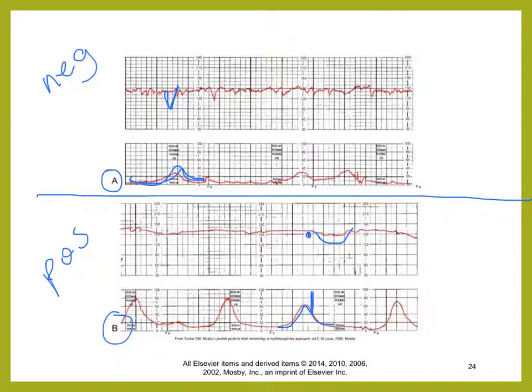So for right now, with CST, that's all we're going to talk about. Negative, positive. In class, we're going to talk about the other 3 interpretations. The most important 2 are the ones that you're looking at right now. So we will talk further about these in class. And if you guys have any questions, bring them with you. We'll go over them again. And this concludes Chapter 10.